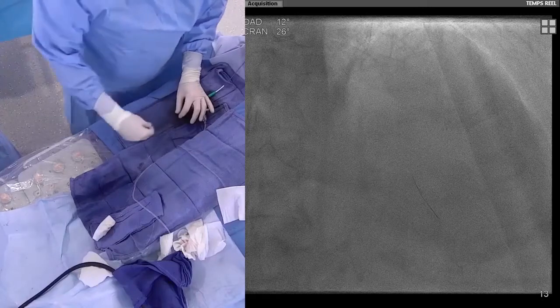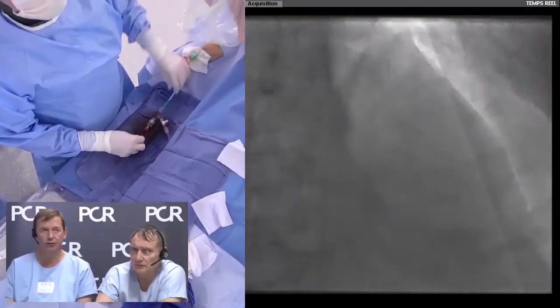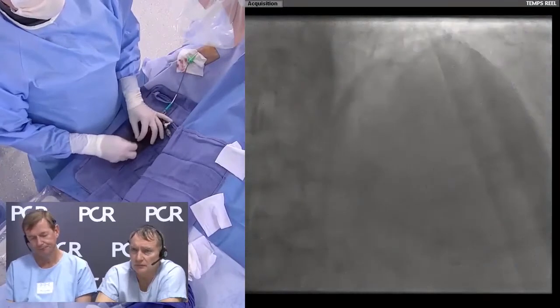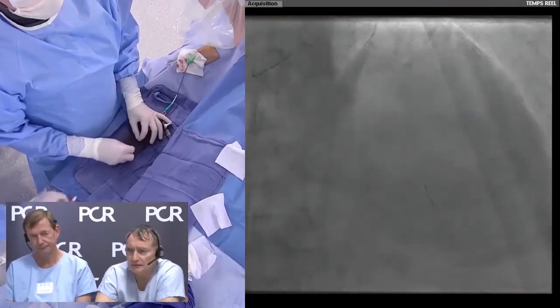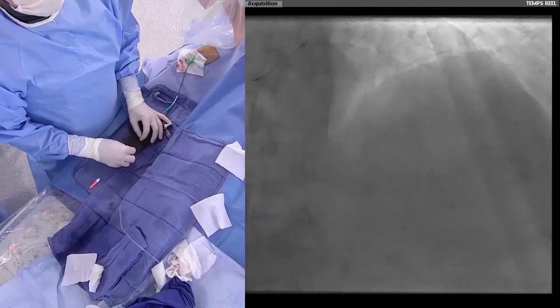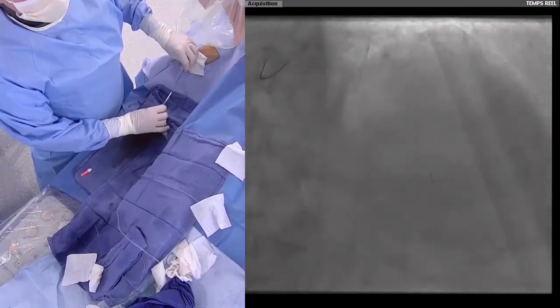We've had a request about the detail in the cocktail flush, Emanuela. I'm not sure if you can just take us through that. So the cocktail flush was saline, heparin, and nitrates. That is what is used here in Toulouse. And maybe the nurse can tell us the dose of nitro and heparin you put in there.